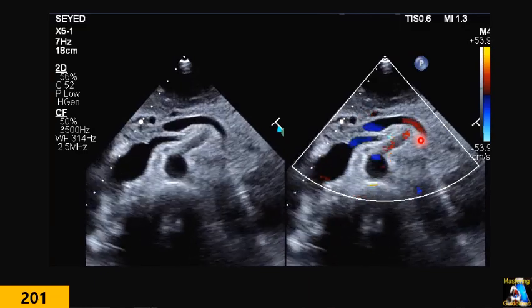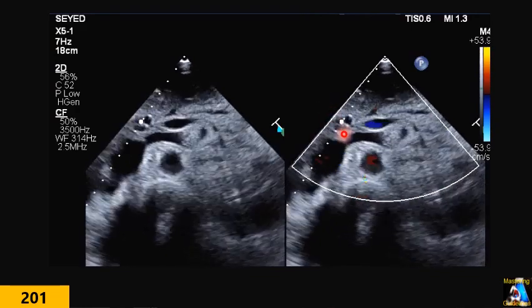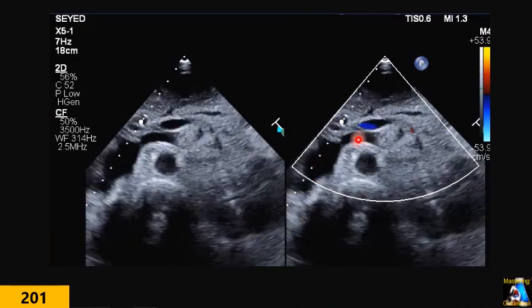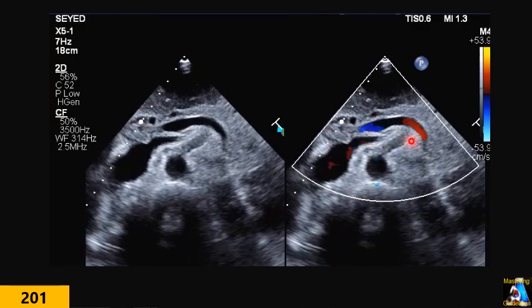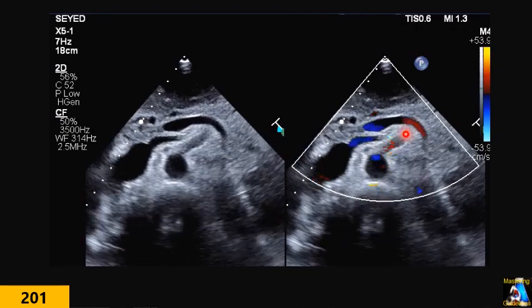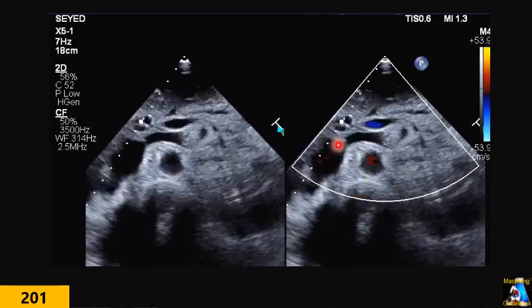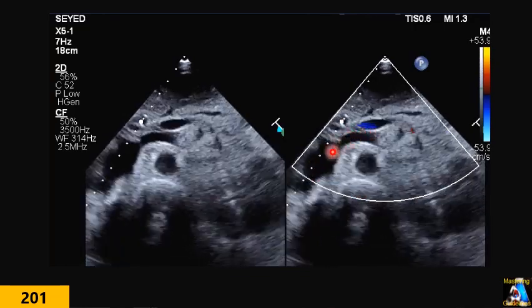You can see based on this, for example, if the patient has portal hypertension, blood flow becomes reverse, going from this side. So here you can see red and here you can see blue in the portal hypertension. Here you can see the celiac artery, you can go there and it has two branches. Here you can see the blood flow goes this way, draining.